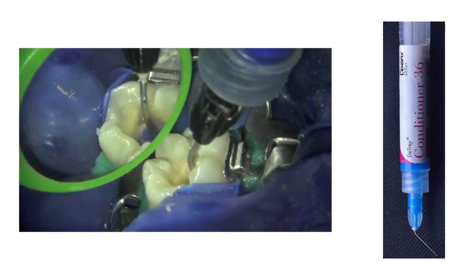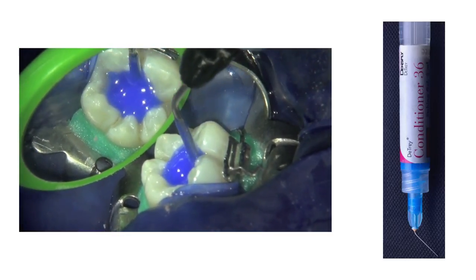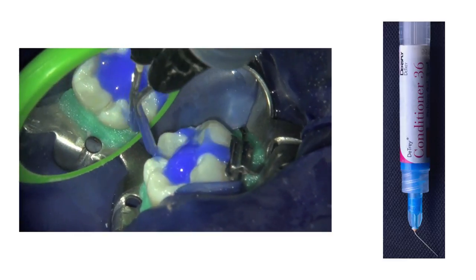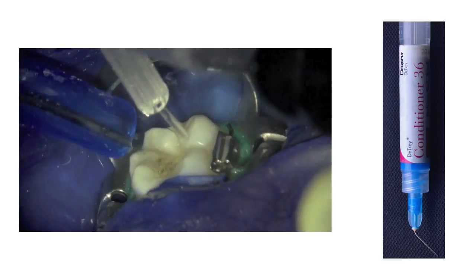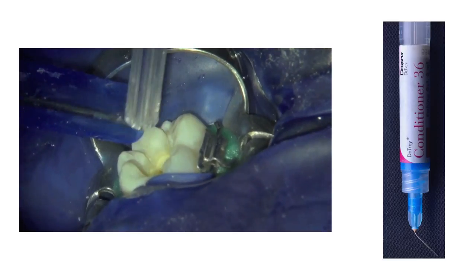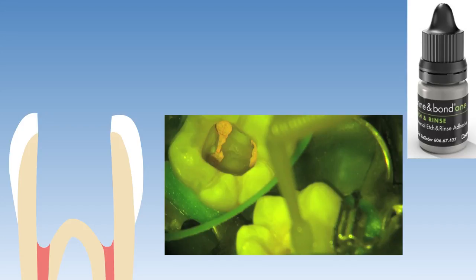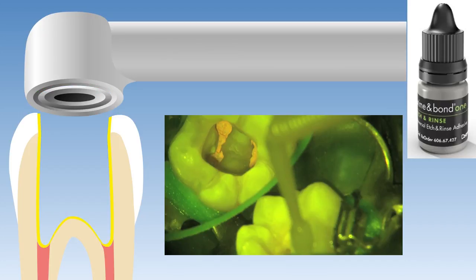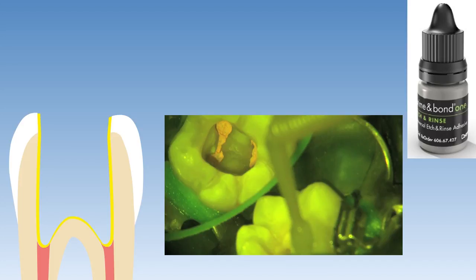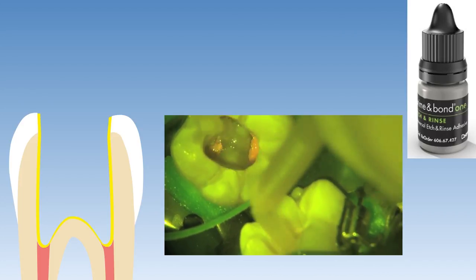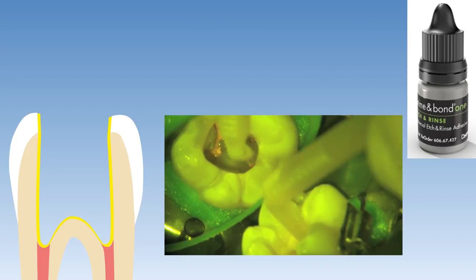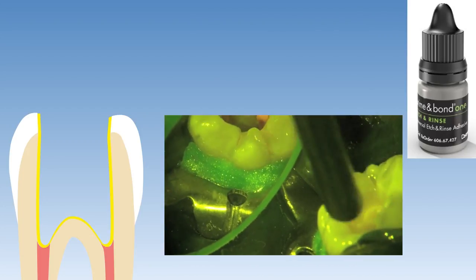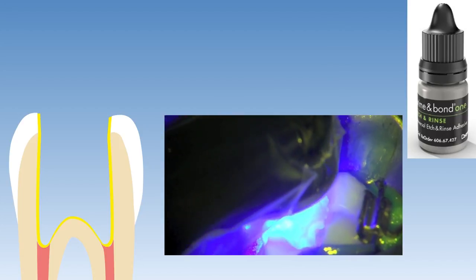The enamel and dentine was etched with phosphoric acid for 15 seconds before the etchant was rinsed off thoroughly with water and lightly air dried with compressed air. A micro brush saturated with Prime&Bond etch-and-rinse was used to infuse the bonding resin into the etched enamel and dentine surfaces for approximately 10 seconds, before it was light cured for 20 seconds after evaporation of the solvent. Here we can see this step being performed clinically — bonding resin application, infusion into the etched surfaces, solvent evaporation, and finally the light curing step.